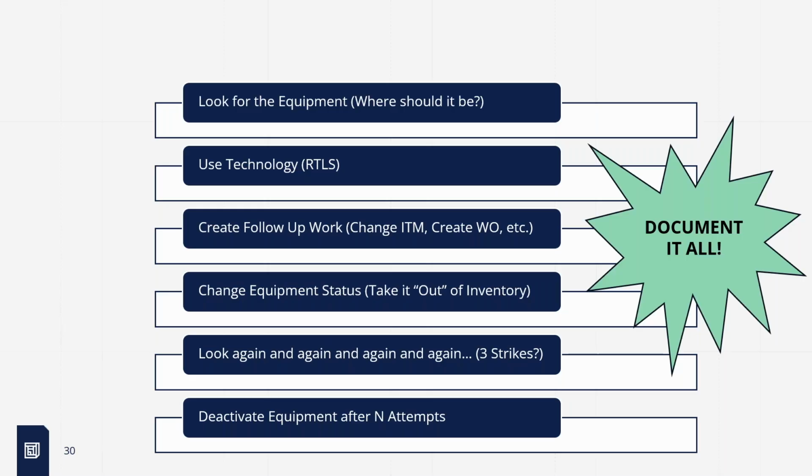So usually for compliance you're okay, but if you're starting to do reporting on the capital planning side, on what models are failing and what manufacturers are failing, you're going to have a pie chart that's literally 1% slices, an unreadable pie chart, versus your top failures. So standardizing is important. If you want to add on.